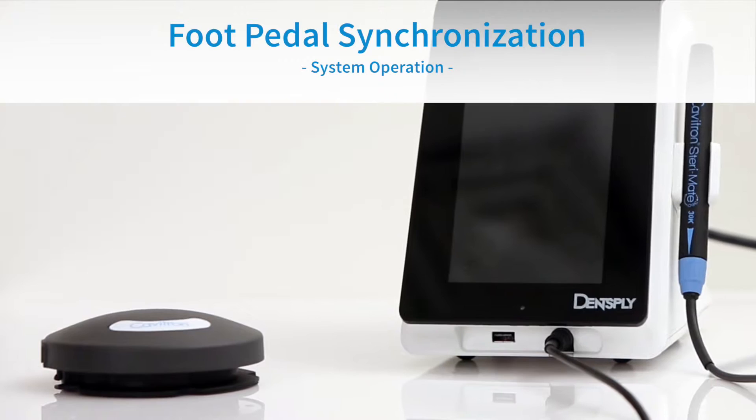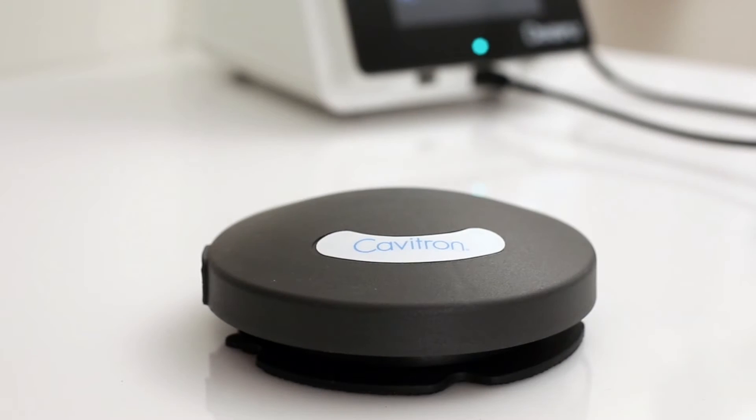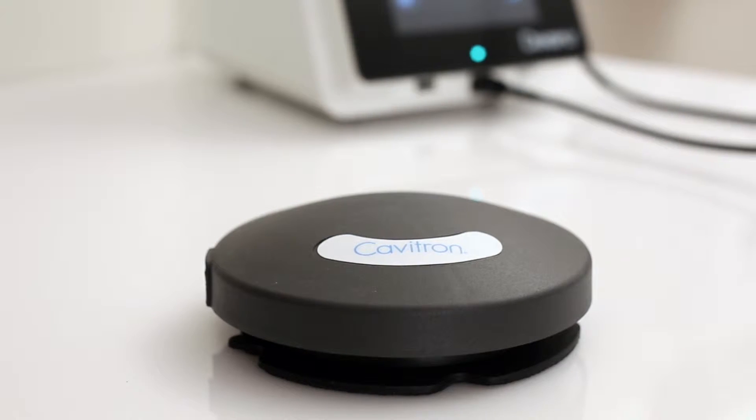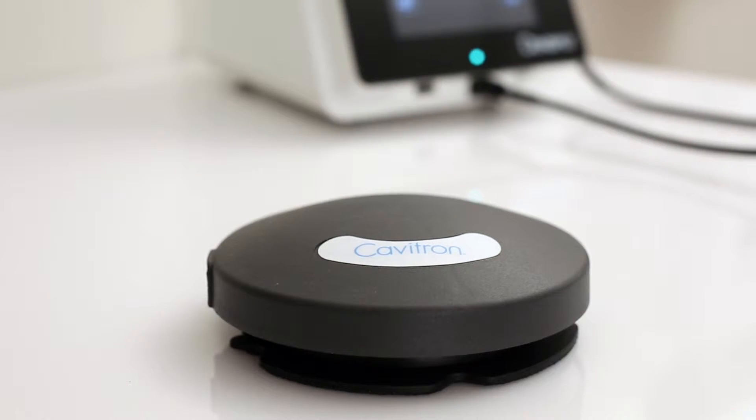Tap-On Foot Pedal Synchronization. The tap-on wireless rechargeable foot pedal supplied with your system has been factory synchronized with the base unit. Should a replacement foot pedal be necessary, synchronization will be required prior to system operation.